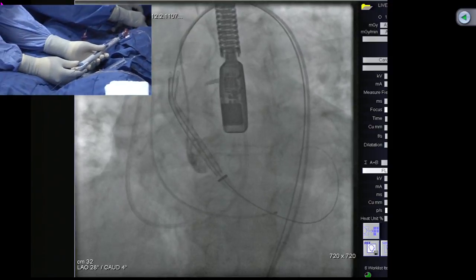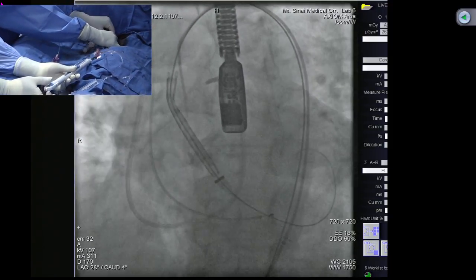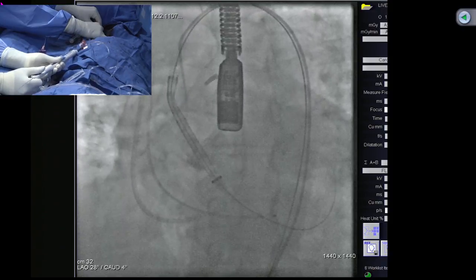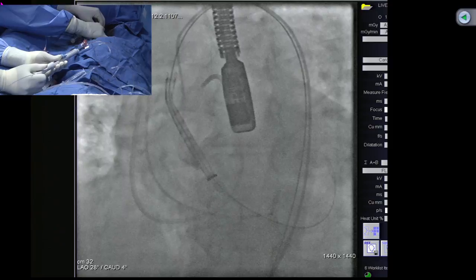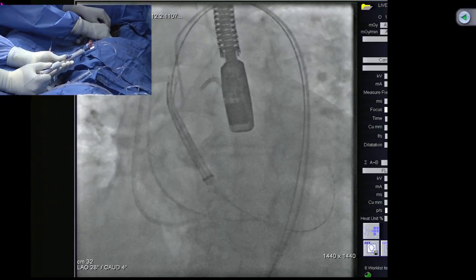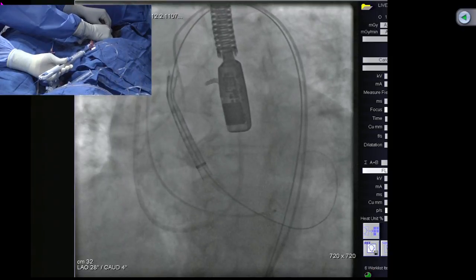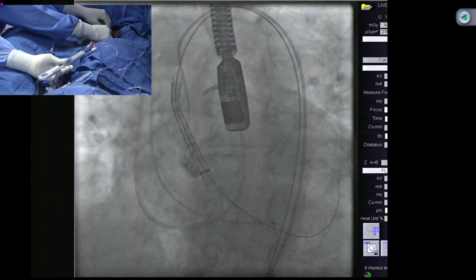Inject. Looks good. I think it looks okay. It's going to start releasing now. Our goal is to go lower than usual. Okay, we'll stop here. Yeah, it just moved down. Okay, going cine again. Inject. I think so far we are doing good.